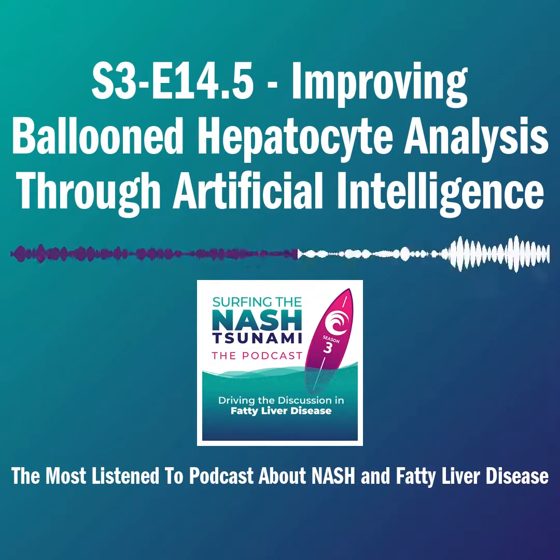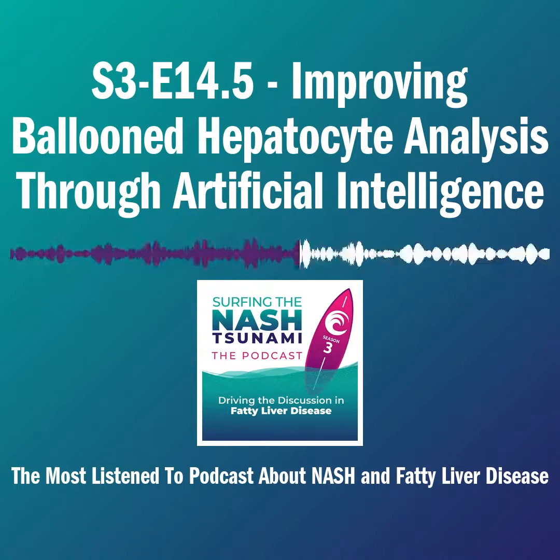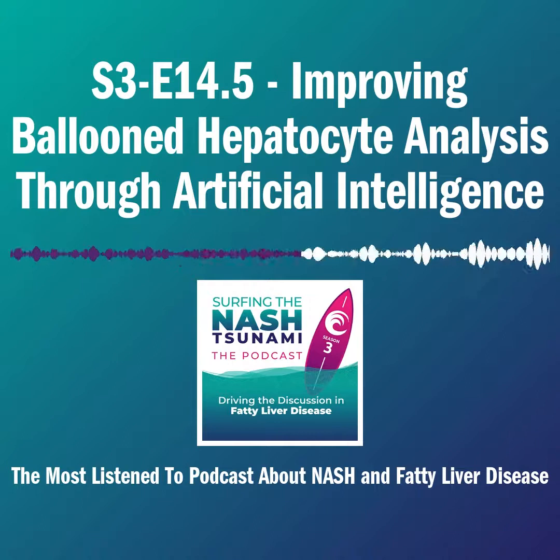Garcia-Tsao was studying back then, and she was saying that conventional histology looking at fibrosis might be missing a few important elements of the cirrhosis architecture. She started looking into a few things in the cirrhosis architecture, such as septal thickness, which we know is very important in cirrhosis, and even in the NASH field.